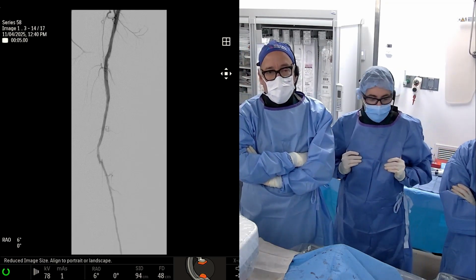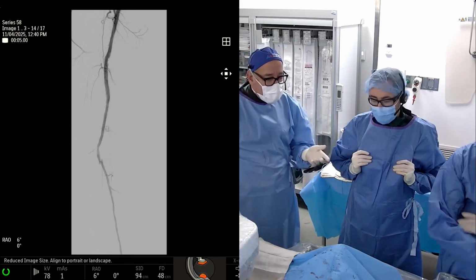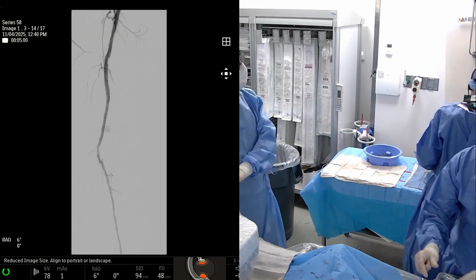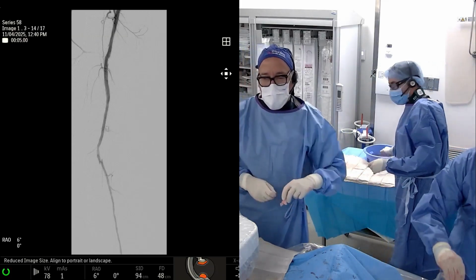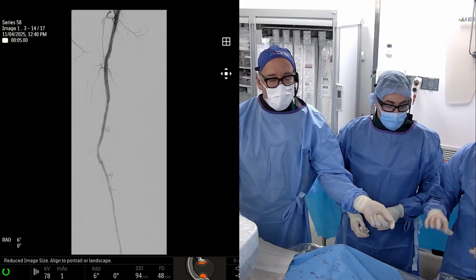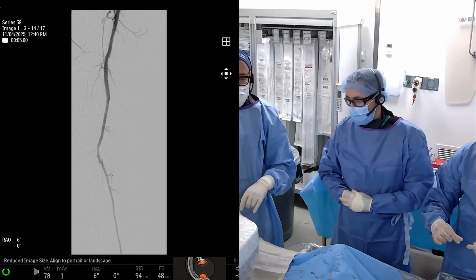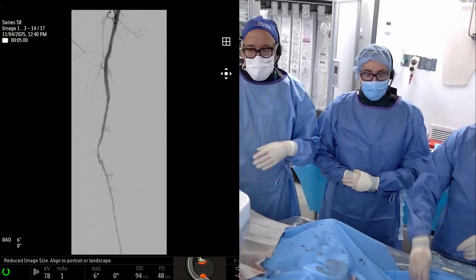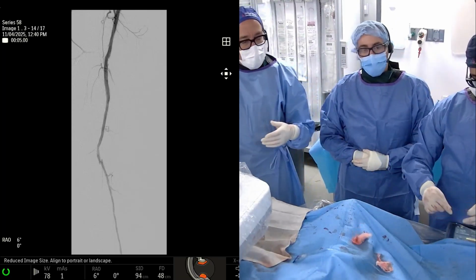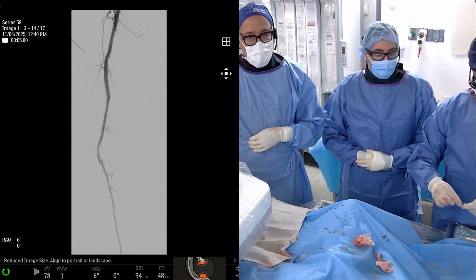And was there any thought to re-IVUSing at this point to see what? We can totally do that. We can absolutely run IVUS. I want to be sensitive to that we're either running out of time or about to run out of time. So I'm happy to do an IVUS, and everybody weigh in on what we're going to do, and we can finish it off camera, obviously. But I think this is a great opportunity for teaching and let intravascular imaging guide us. If anybody else feels strongly, let me know, but we are all set to go with another round of IVUS.